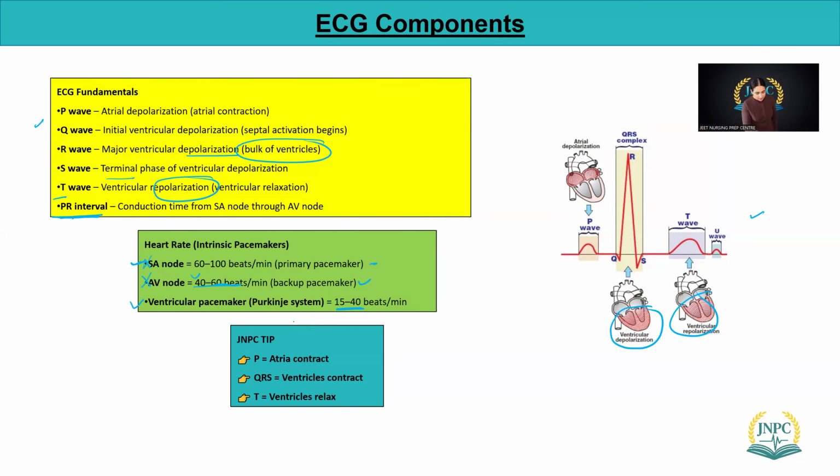Okay. So P, we have done that. QRS, ventricles are contracting, that is just general. So by this time, I want you to think again. Take a break, think again what we have learned so far. Was it easy and making sense? Or is it too tough, going over your head? Not hard, it's easy, right? Very easy. When you use your concept, these are very basic things.